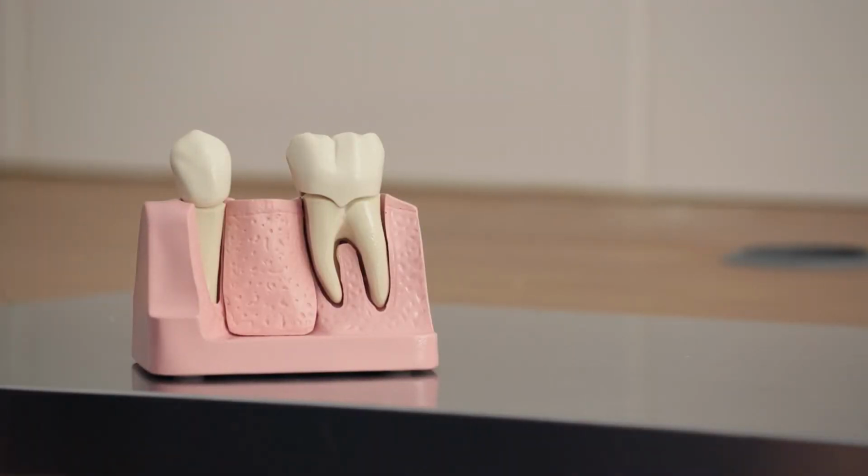So the example that I'm going to be showing you today is a very common problem that patients come to see us with. This is essentially a missing tooth. As you can see, we've got a tooth missing here between two natural teeth, and essentially we've got three options usually for a missing tooth.